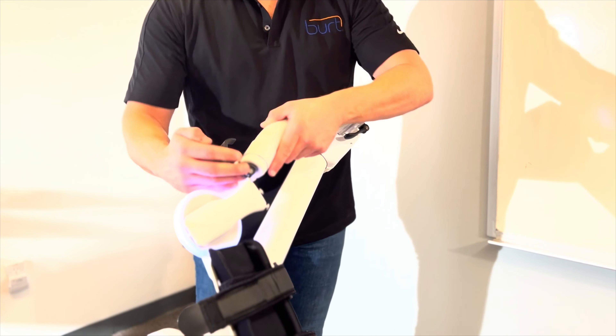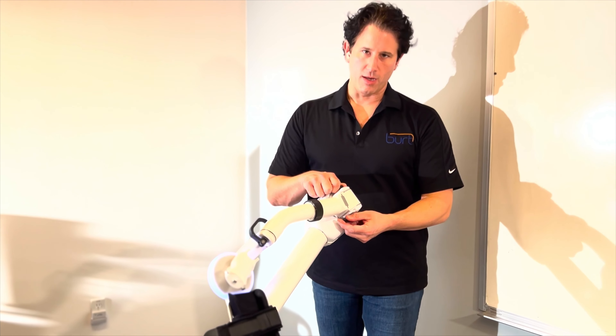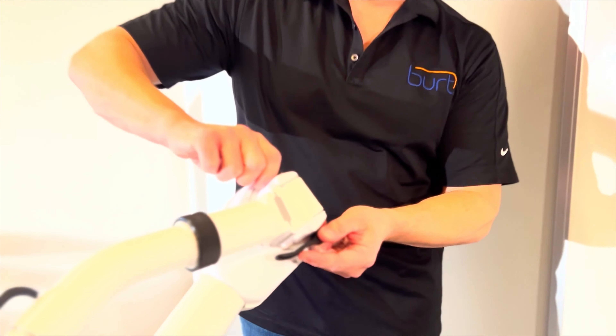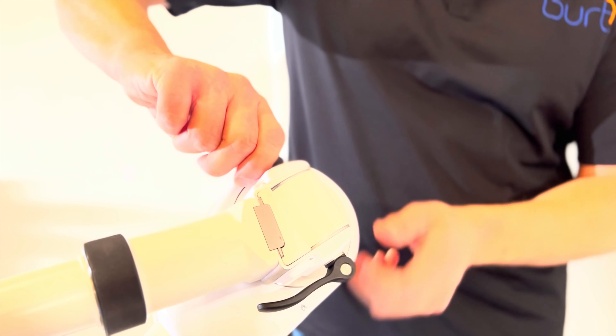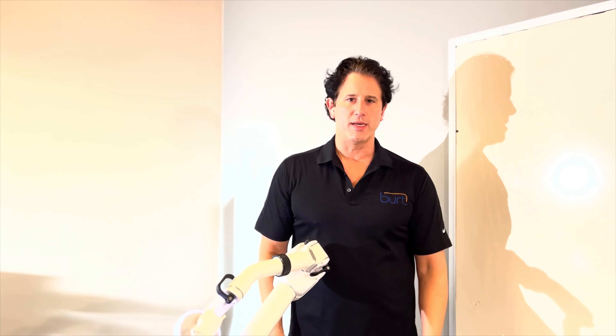One final thing is, when you switch these from left-handed to right-handed, when you're using this lever here at the elbow, you might want to tighten it every once in a while. This is like a screw right here — just hold it and tighten it. Because over time that'll get loose, and if the patient's using it, it'll come out and you'll get that yellow error message.